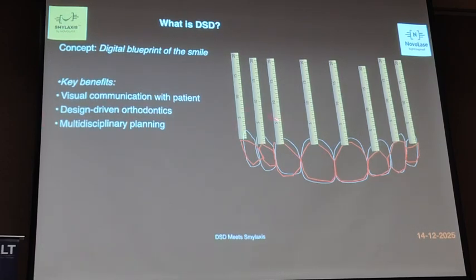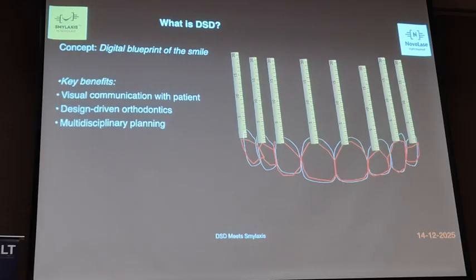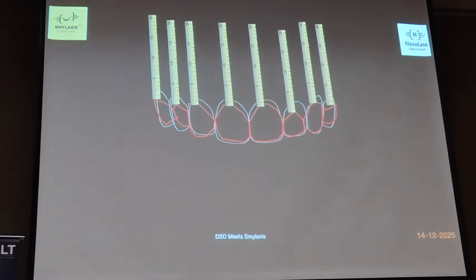But what about these white lines? That has to be corrected by your laser, that is CLP, right? Correct. This is the reason why we included digital smile design in the aligner concept. And the second is to reduce the time taken by conventional aligners. Got it?